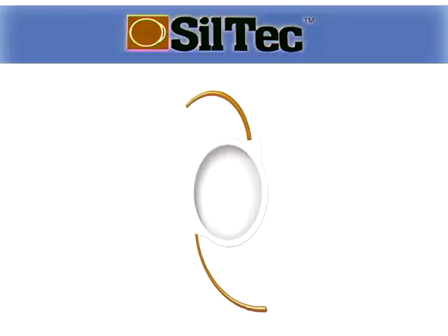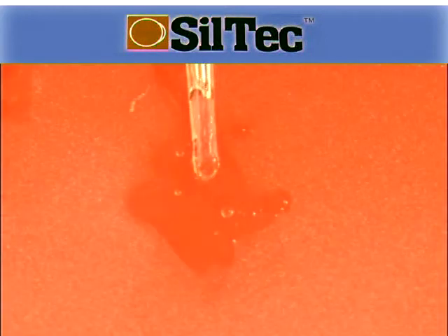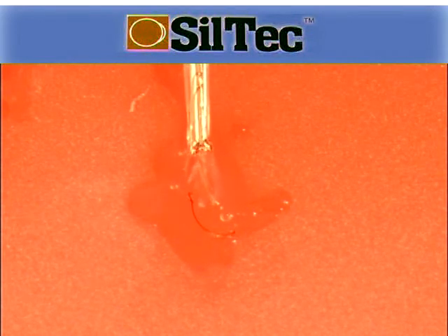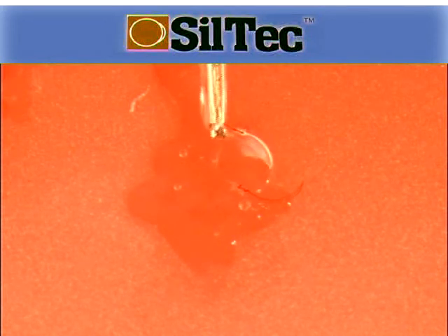As stated at the beginning of this section, the Siltec is a three-piece silicon lens of a similar design to the LH3000, and so should be loaded with exactly the same procedure. However, due to the nature of the silicon material, it needs to be injected much slower into the eye.